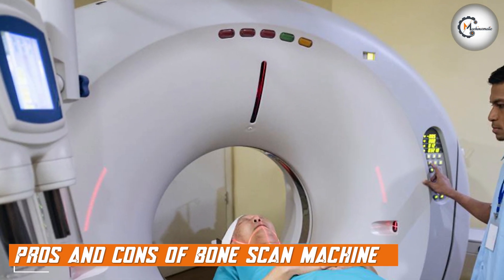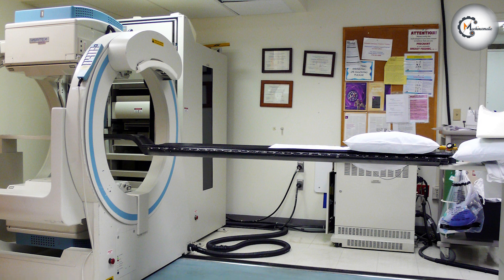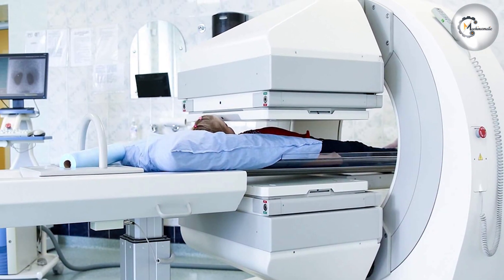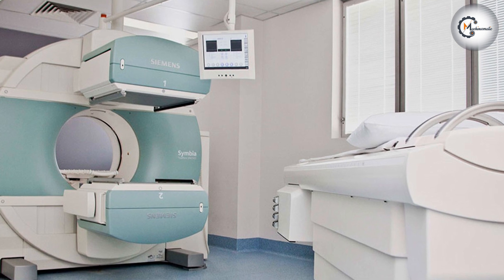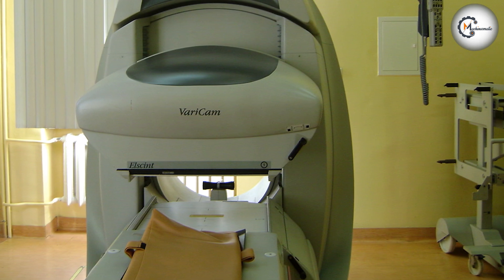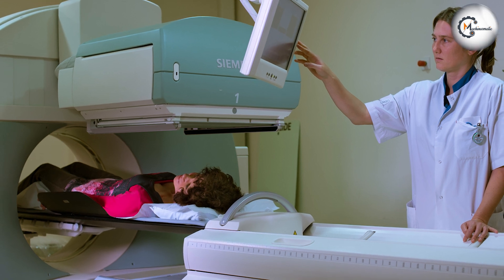Bone scan machine has several pros and cons. One of the biggest advantages is its ability to detect bone abnormalities at an early stage, helping doctors diagnose and treat conditions before they become more serious. It is also a non-invasive procedure that does not require any incisions or anesthesia, meaning there is no risk of infection. However, one of the biggest disadvantages is that it uses radioactive material, which can be harmful if used in excess, and there is a small risk of allergic reactions.